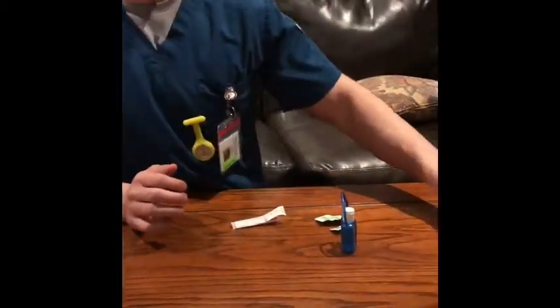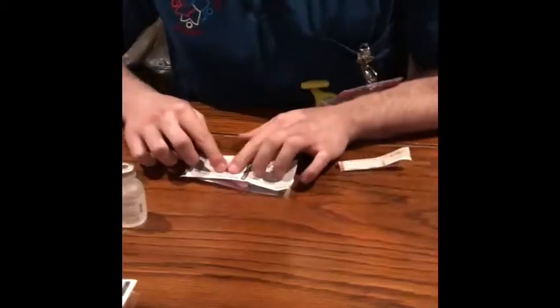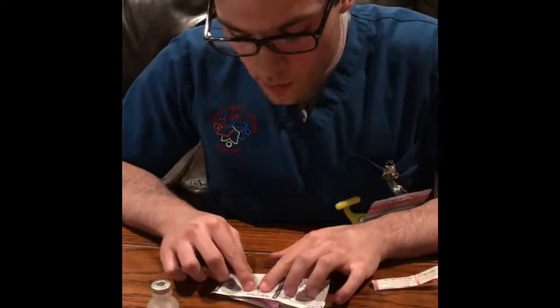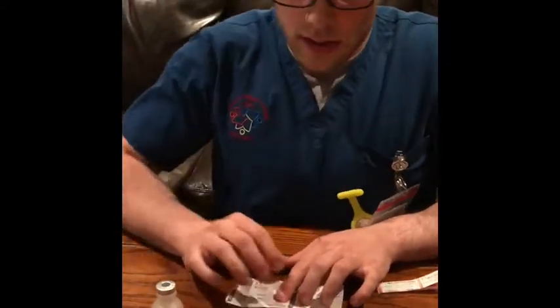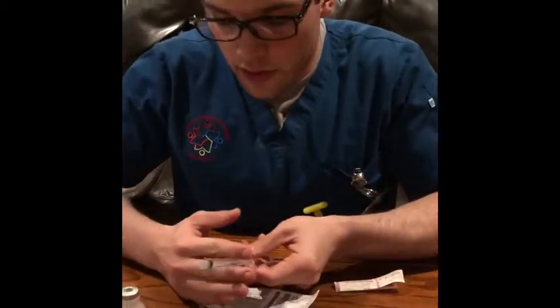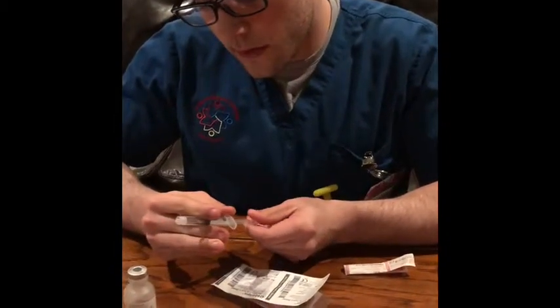So then we would grab our intramuscular needle, and once again, make sure that the gauge is appropriate and the volume is appropriate for an intramuscular needle. So 22 gauge and 3 milliliter needle. That one there seems to be within range. And once again, taking the plunger and drawing it back, ensuring that it is functional.